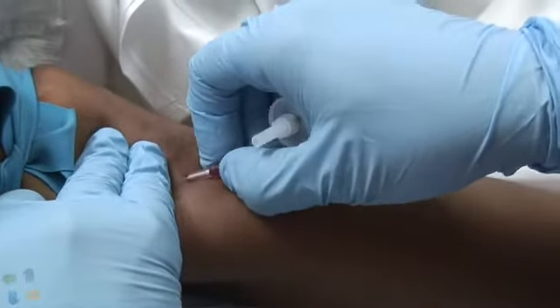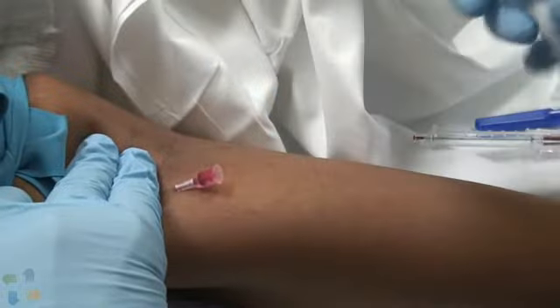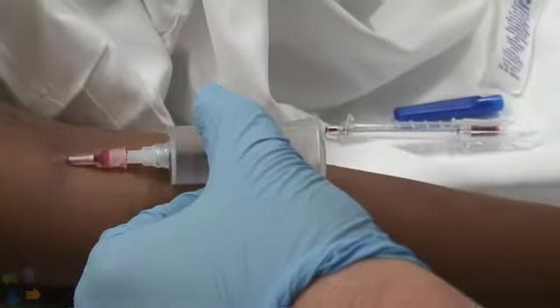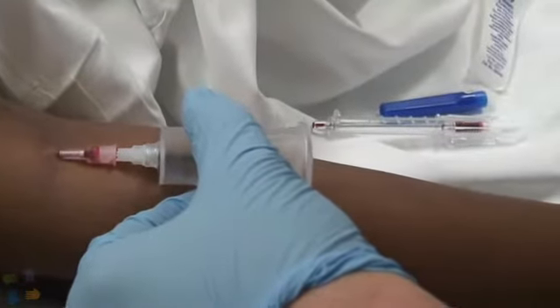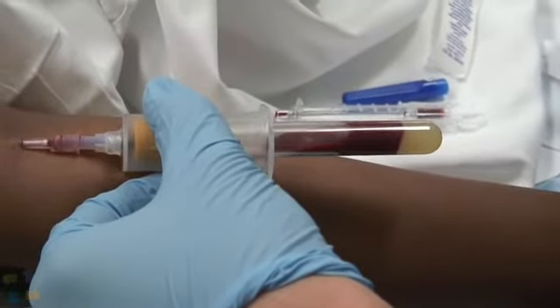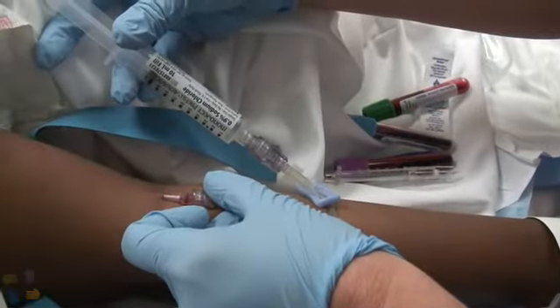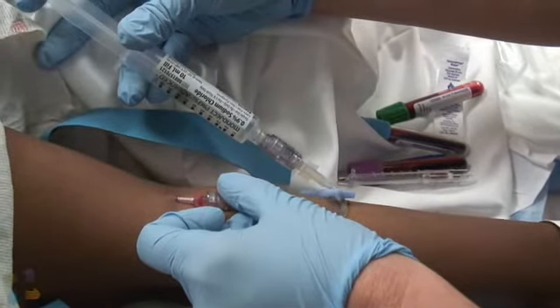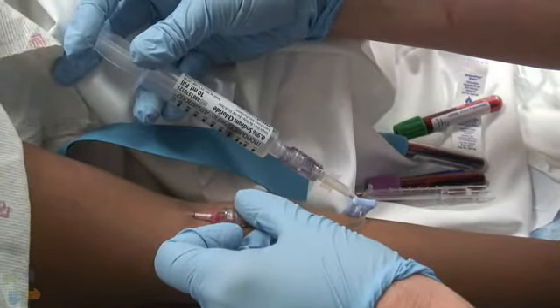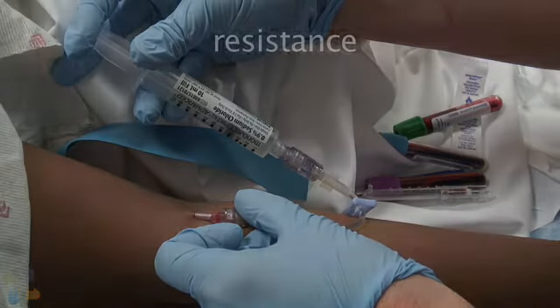Remove the needle and occlude the tip of the catheter to prevent extravasation of blood. Remove your tourniquet. If needed, attach the blood transfer device and draw blood by placing the vacuum tubes onto the covered needle. After blood draw, flush the catheter with 5 cc's of saline. The saline flush should flow smoothly into the catheter.